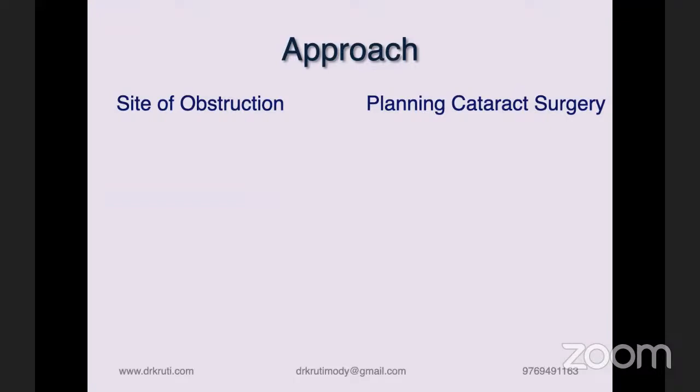Okay. And then for these common canalicular blocks, you use a probe as well. Then do probing. You always keep a probe in the OPD and always probe. Even if you have any kind of obstruction before your sac area, always probe and ascertain at what level you are getting your obstruction. Okay. Did I answer your question?